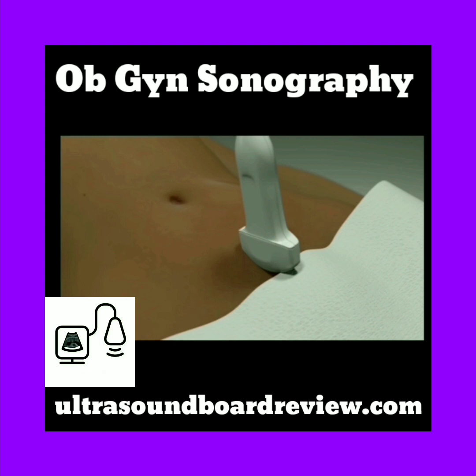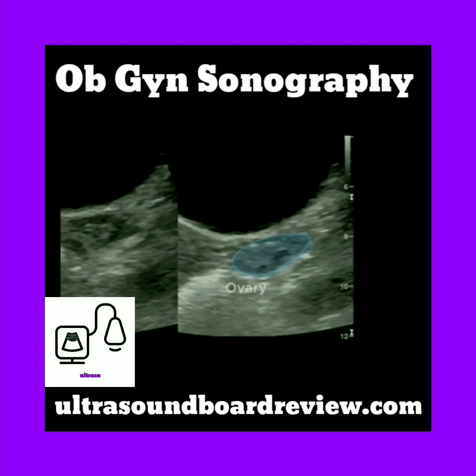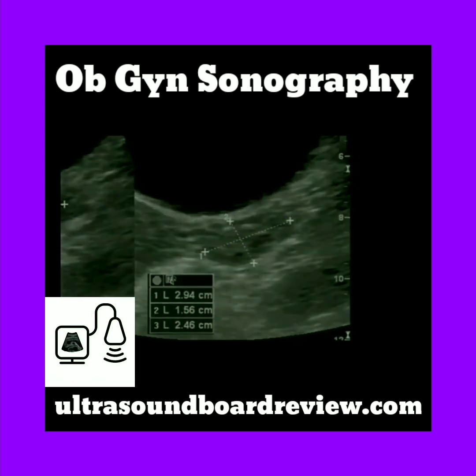The ovaries are difficult to visualize at times using the transabdominal approach. It may be helpful to scan obliquely to visualize the ovaries. Ovaries appear hypoechoic as compared to the surrounding structures. The follicles may be visible inside the parenchyma. The normal ovary measures about 3 centimeters in length and 1 centimeter in the antero-posterior dimension.